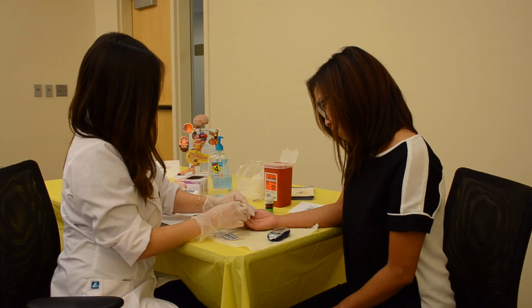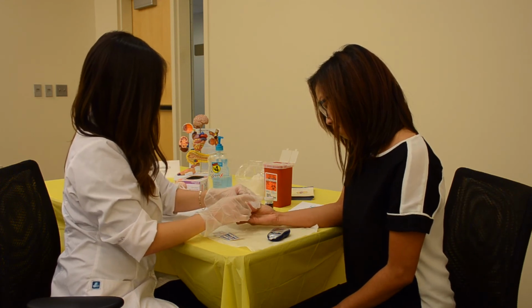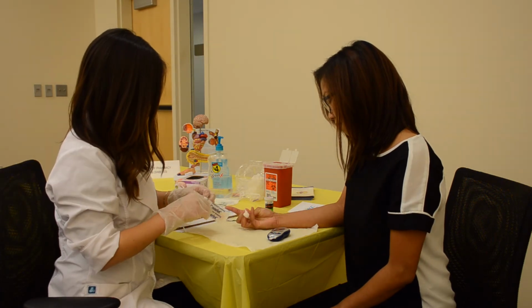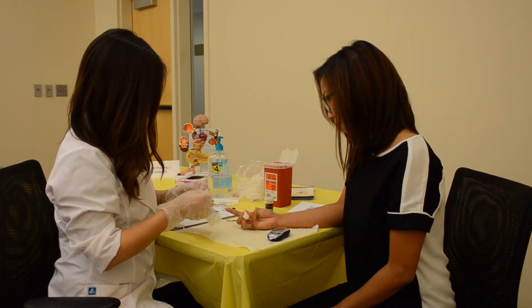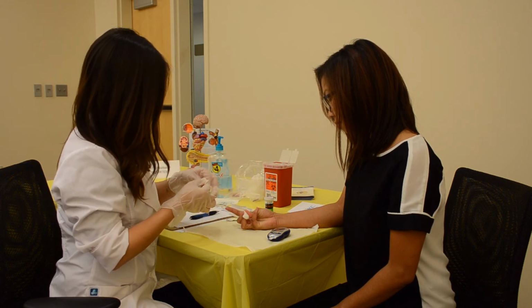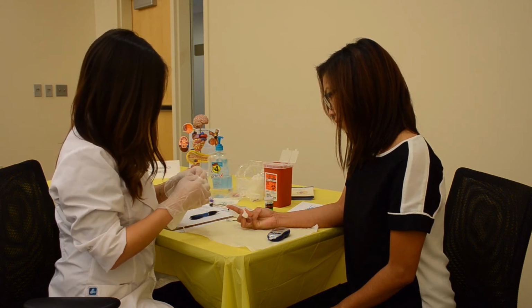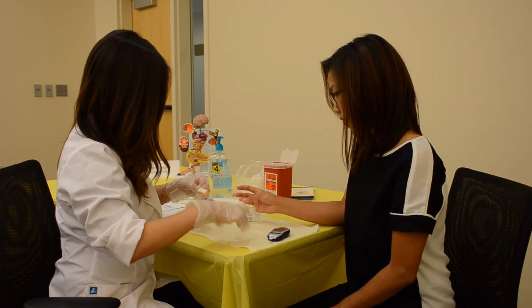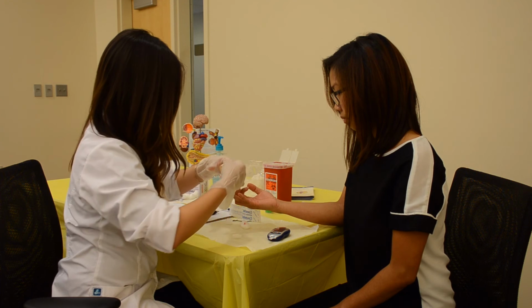You now have a little bit of blood sample. Squeeze the finger just a little bit to get the amount of blood you need. Touch the tip of the strip to the blood drop. The meter will give you a result. Apply a cotton ball to the pricked finger to absorb any excess blood. Apply a Band-Aid to the finger if the patient would like one.